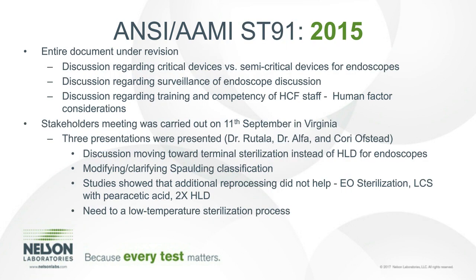The ST91, this is for flexible and semi-rigid endoscope processing in healthcare facilities. This topic has gained a lot of attention due to scrutiny the endoscope received from the regulatory bodies regarding reprocessing in the last few years. This document is currently under revision, and a lot of work has been done in the document to update the sections that needed attention.